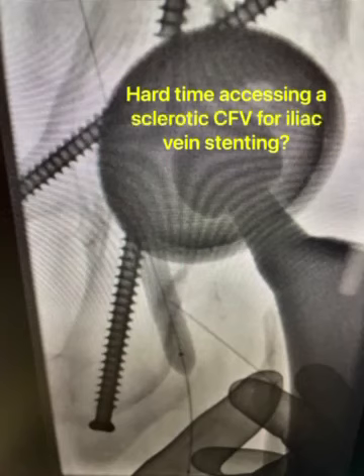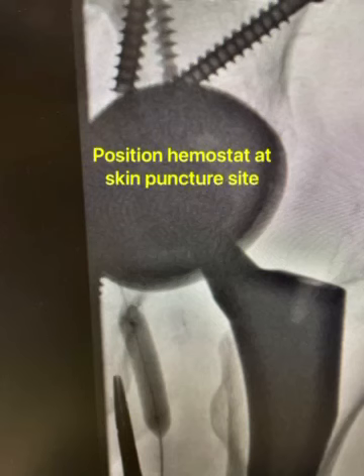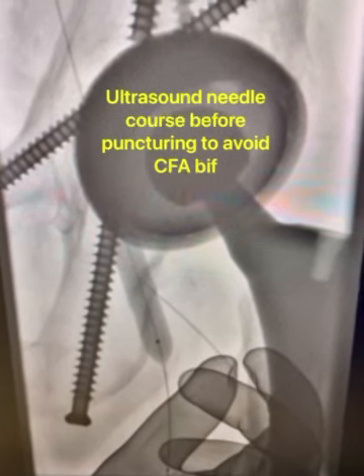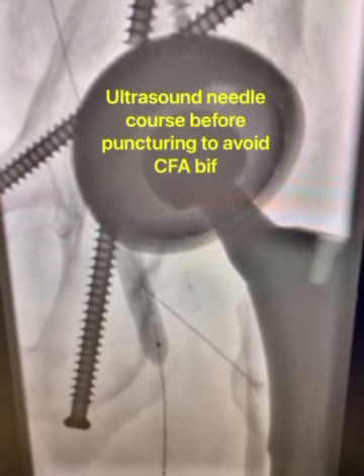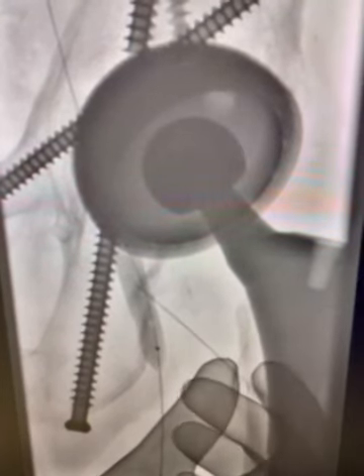So in this case, after multiple attempts at accessing the common femoral vein, which was again very diseased, under ultrasound guidance failed, we decided to inflate a balloon from a tibial vein and place a hemostat on the skin to allow for adequate positioning of the needle. And then the balloon was punctured under fluoroscopic guidance.